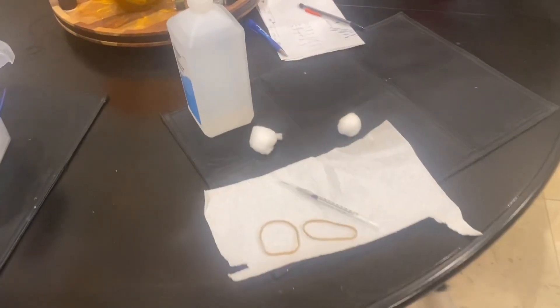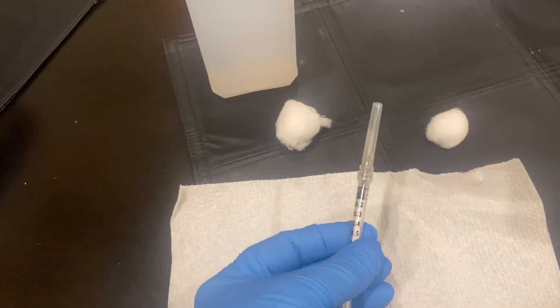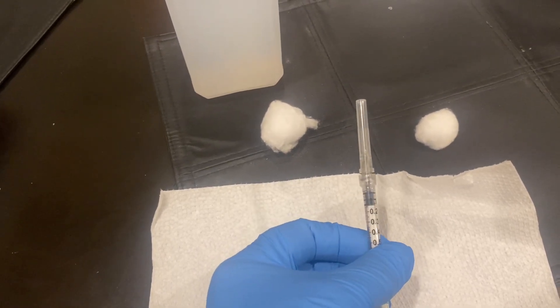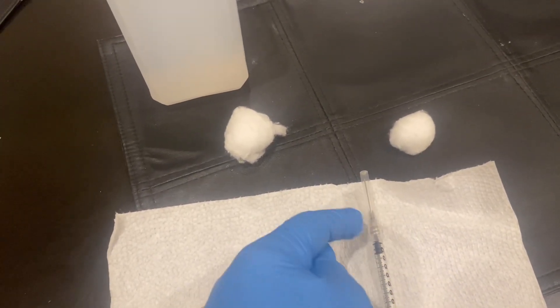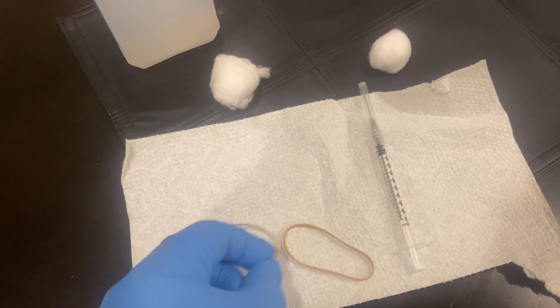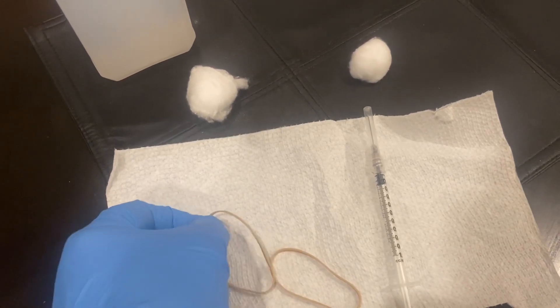We may be past the temperature drop, so now it's time to pull blood. To get ready we need a one-mil syringe — big syringes pull the blood too fast and you can get what's called hemolyzation of the blood, which is not good. You want to use a small syringe. Use an 18-gauge needle and make sure it's securely on. We sell tourniquets, but I can't find mine — I think our daughter Chanel has it — so I'm going to use a couple of elastic bands to make a tourniquet.